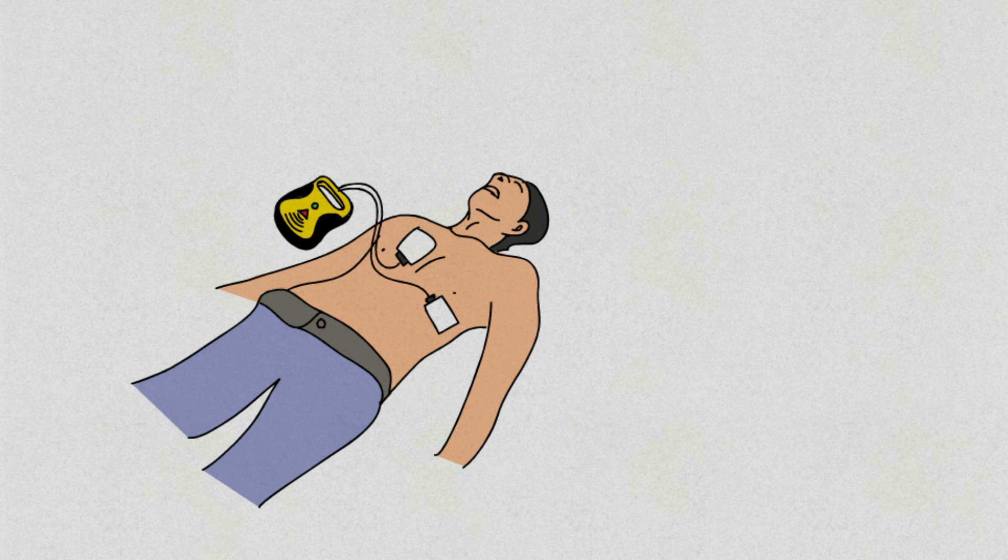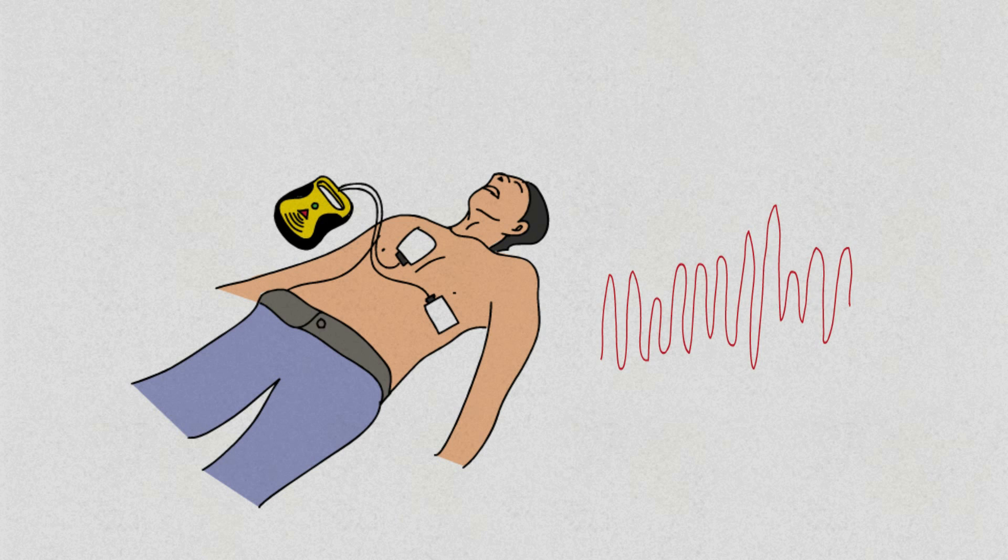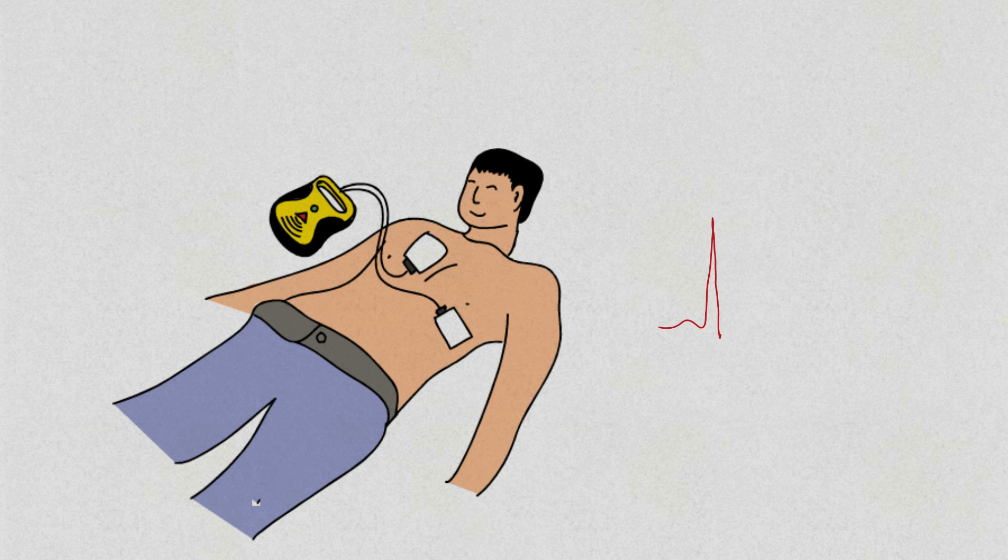The main life-saving treatment during such times is usually an electrical shock to the heart, also known as defibrillation. However, this may not always be readily available.